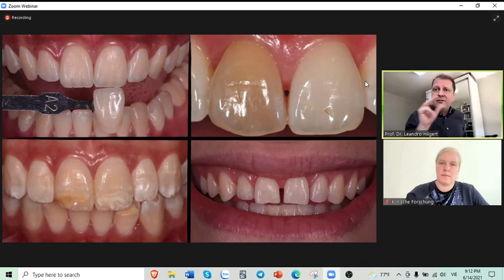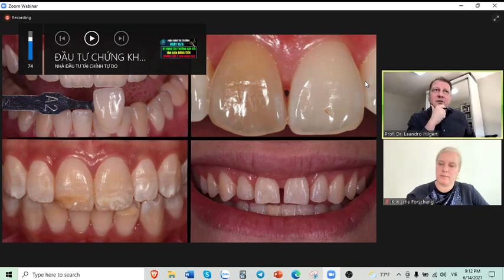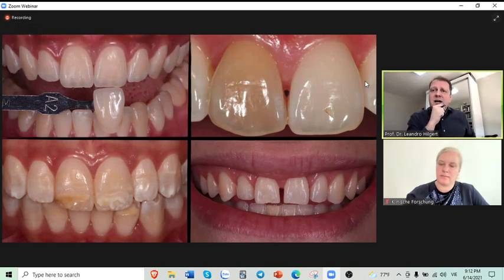So I have here four pictures with four different problems that those patients presented to me here at our clinic at the university. The first one, on your upper left corner, is a patient that had beautiful natural teeth, and she just wants whiter teeth. What am I going to do when the problem of my patient demands a correction that is just color? I don't have anything to change here in terms of form, especially because she likes her smile like this.